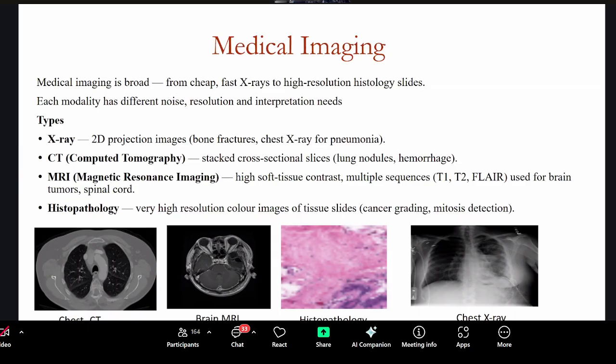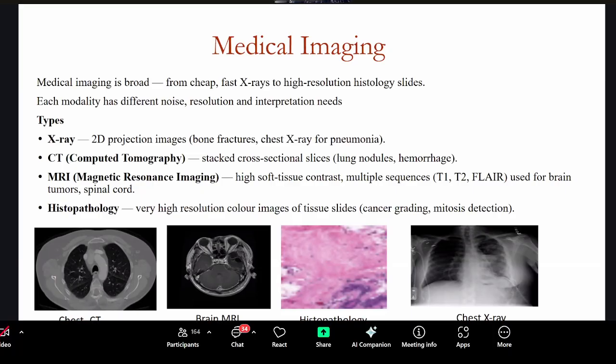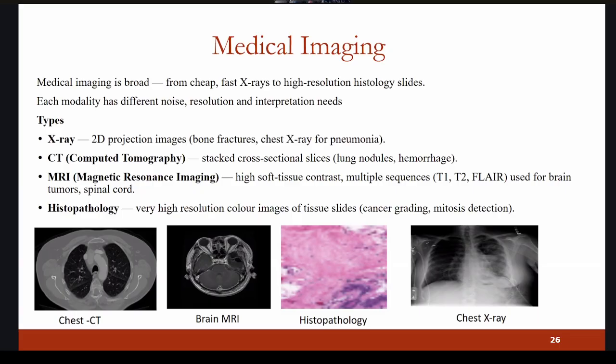In order to show a demo, I showed you the X-ray images, but I have started working on histopathology images for a cancer classification task, where we are finding it very difficult to train, because every image has high resolution and it takes days to train a few images. For example, for thousands of images, it takes 10 days or so.